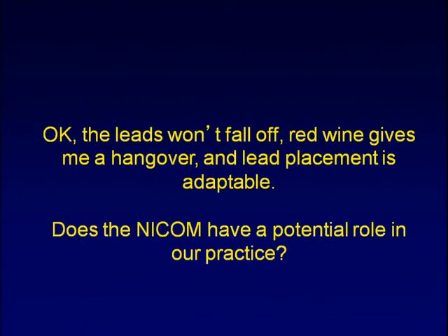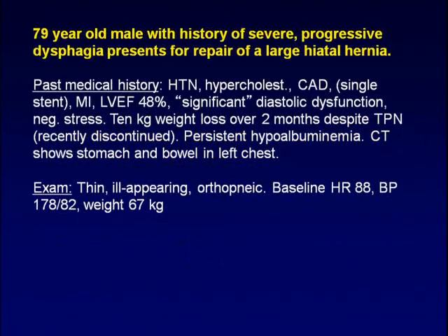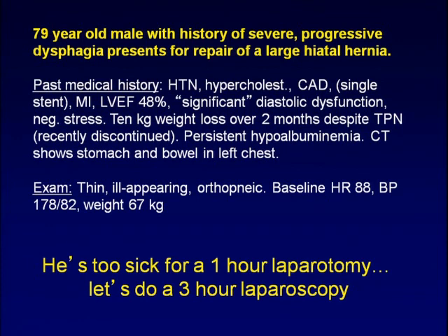All right, the leads aren't going to fall off, and lead placement is adaptable. Does it really have a potential place in our practice? And this is where really the money of all this is. So let's go back to our old man who has a big diaphragmatic hernia and bowel and stomach up in his chest. This guy's coming to the operating room, and to make things even a little bit more interesting, he's too sick for a laparotomy, so let's do this with a 3-hour laparoscopy. It's little incisions, it's got to be better for him, and I'm sure many of you have come across this.